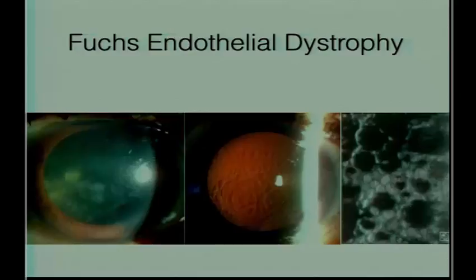I think it is important to do an anterior segment OCT and look at the anterior chamber volume, especially the periphery, and you can plan your surgery accordingly, selecting this case. Once you have tasted success with DMEK, you can gradually move on to a failed graft, or a phakic eye, or even venture out doing a vitrectomized eye with IOL exchange. So I think this is something that can be done. It's possible. I've seen Gerrit Melles show videos of doing DMEK in eyes with AC IOLs. I'm not that brave, but I believe that even that can be done.